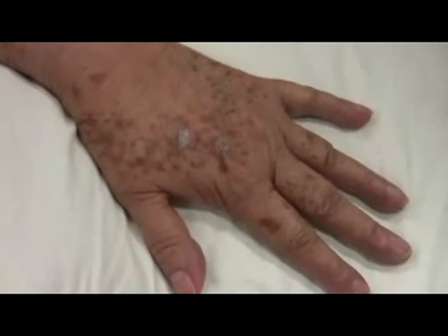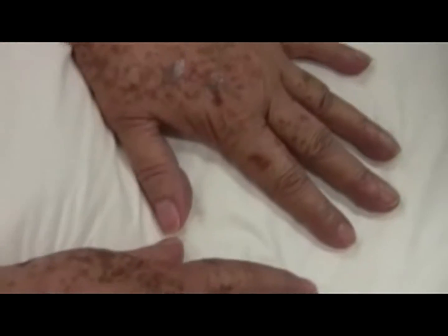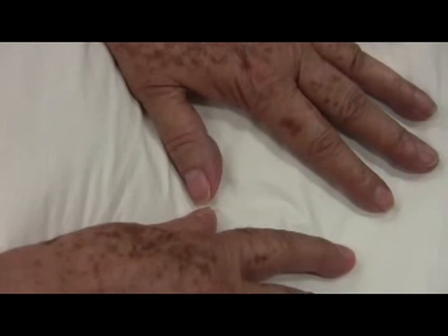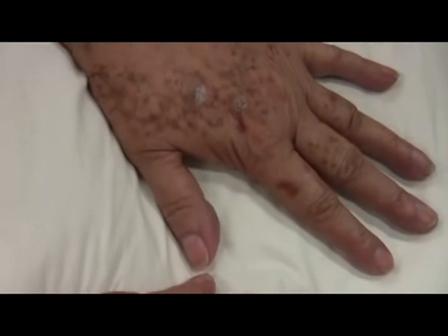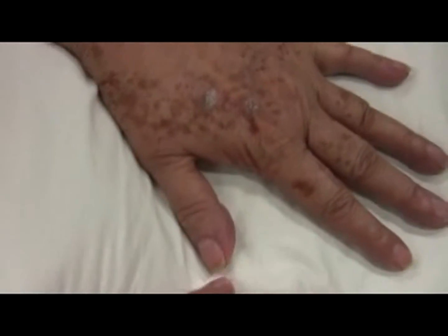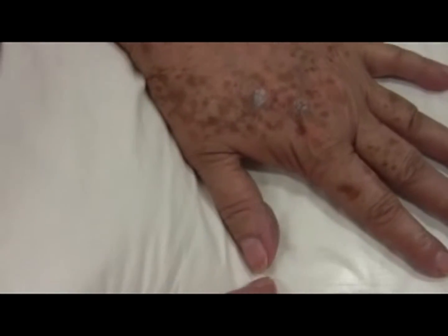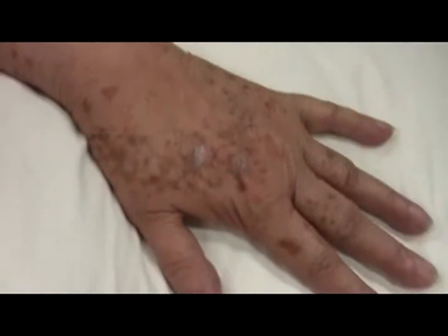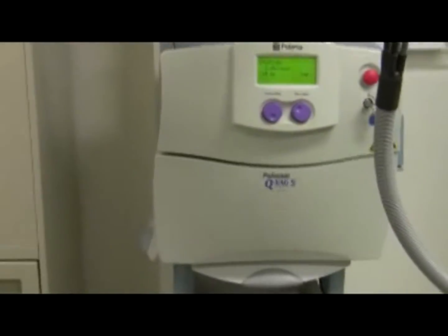More commonly, it's good to start conservatively with a low fluence. The fluence may need to be increased until cavitation — meaning the white crust — is achieved. When finished, let's pretend we completed the whole treatment, since we're not doing the entire treatment on tape.